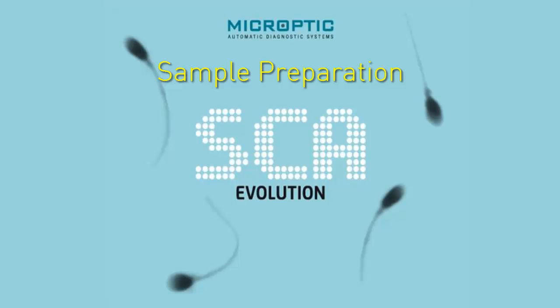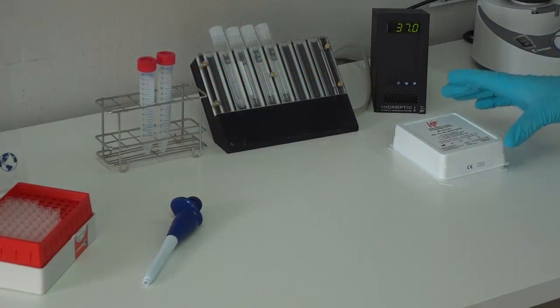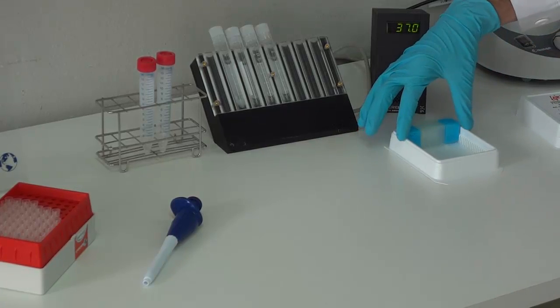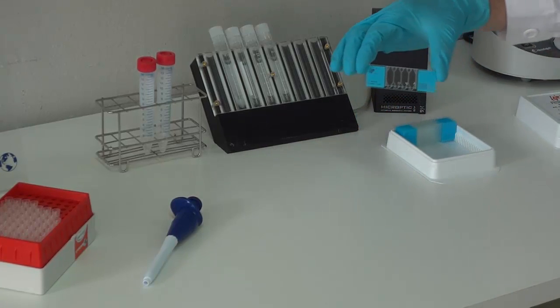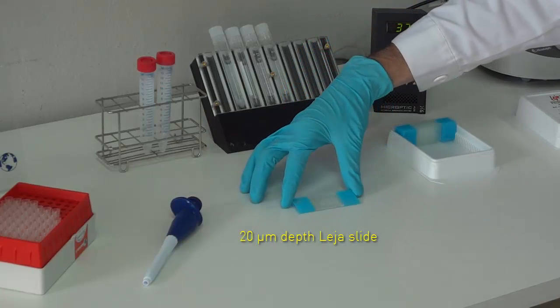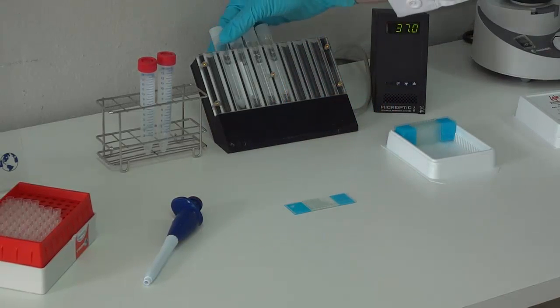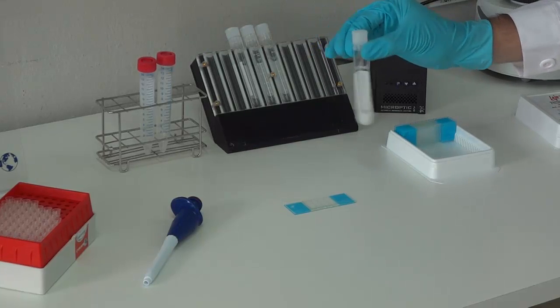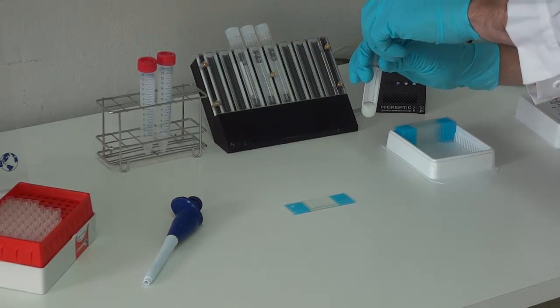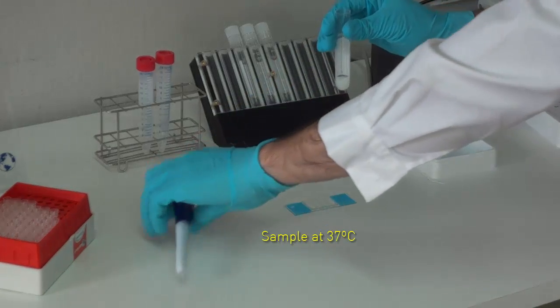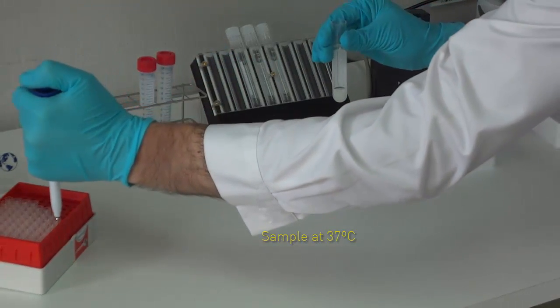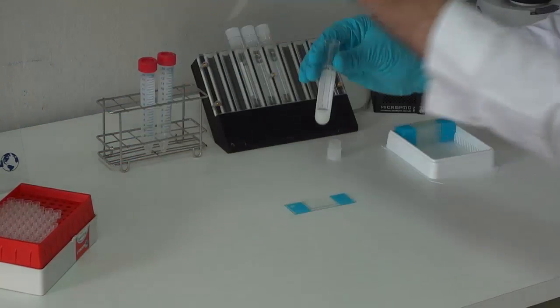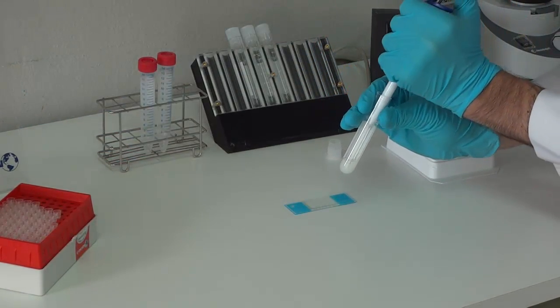Motility and concentration sample preparation. First step is to prepare a sample for motility and concentration analysis. Other disposable slides can be used. Take the sample at 37 degrees centigrade, mix gently, and pick 5 microliters using a positive displacement pipette.